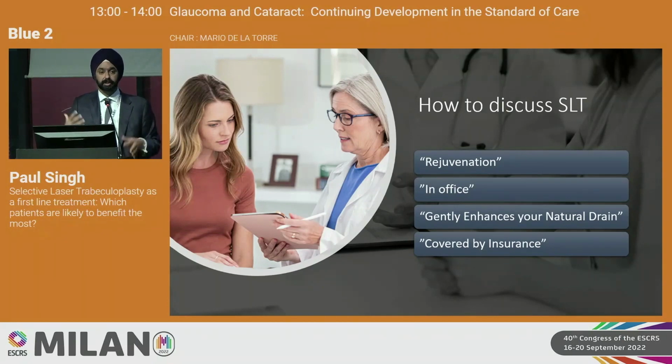So I tell patients, Mrs. Smith, I'm going to use a beam of light that's going to rejuvenate the natural drain. It's going to use your natural enzymes to excite your tissues to open up those pores naturally. In the US, it's covered by insurance. It just takes a few minutes to do, and you get to go home without any kind of barriers to post-op recovery as well. So these are the key phrases. Now, if they say, is it a laser? Yes.